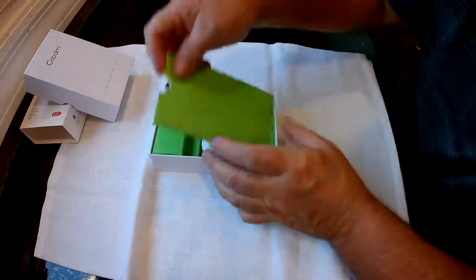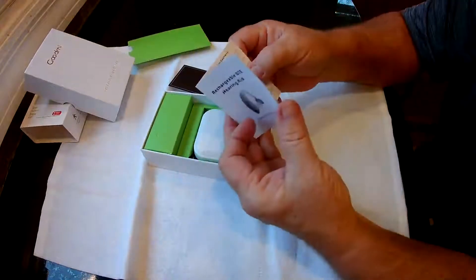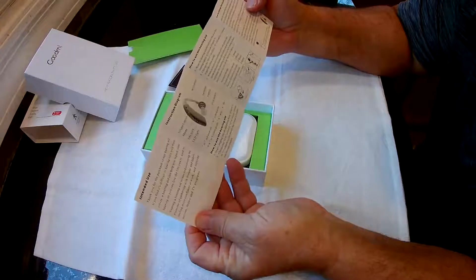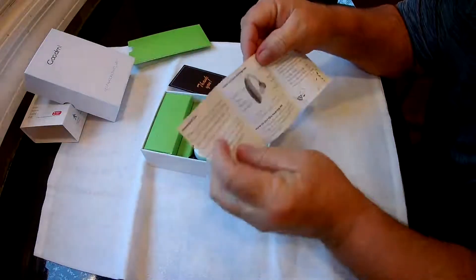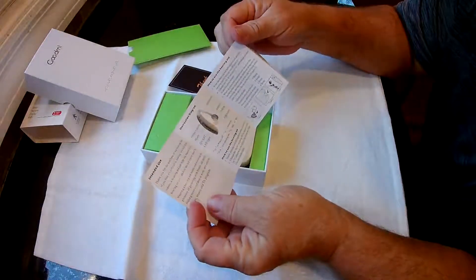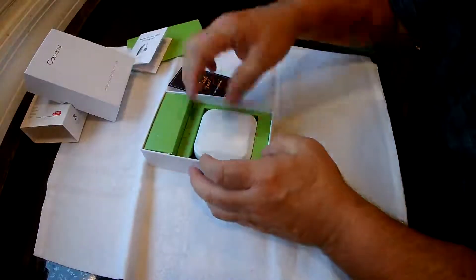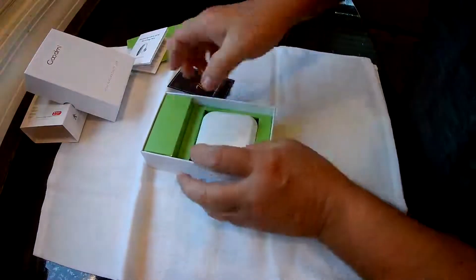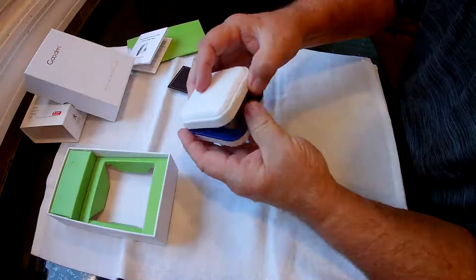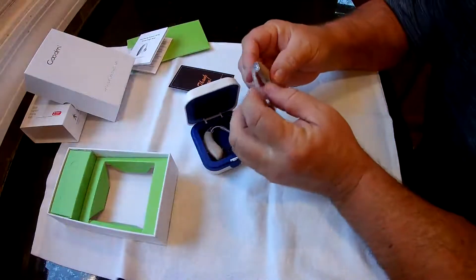In the box you get a thank you card and a manual — it's only a few pages and tells you how to use it. There are four different modes and a noise reduction you can cut on and off. This should be the hearing aids themselves in a nice little carrying case.